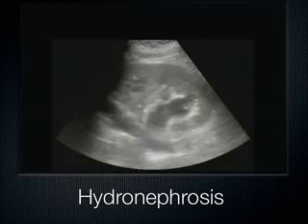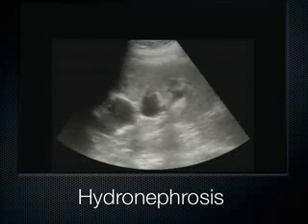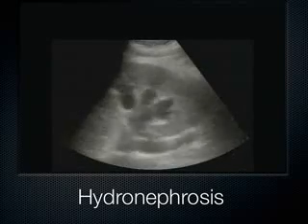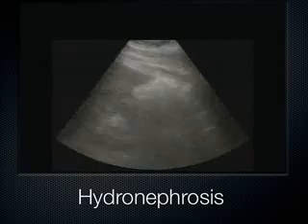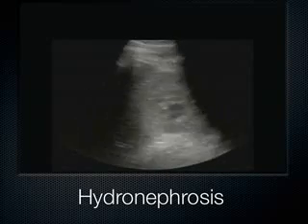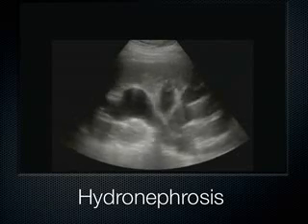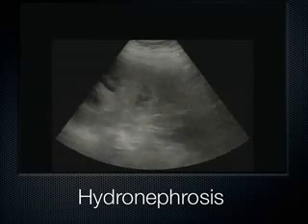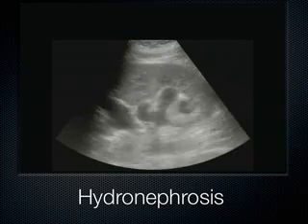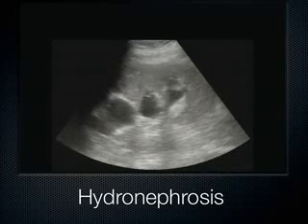But you move on, you see a little bit more. See, we can see the fingers of the glove kind of going out into these different projections. They eventually all coalesce, but not until we get right to the renal sinus does it coalesce down here. So that's another bit of, I would say, mild amount of hydronephrosis. It's a very nebulous grading category, but here it's sort of splaying out a little bit, sort of mild. We can still make out plenty of cortex. This is all cortex out here. There's plenty of cortex left in that kidney.